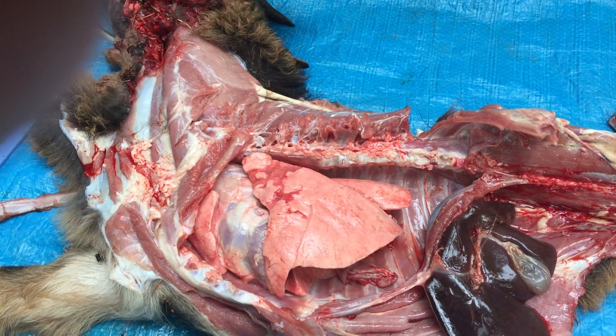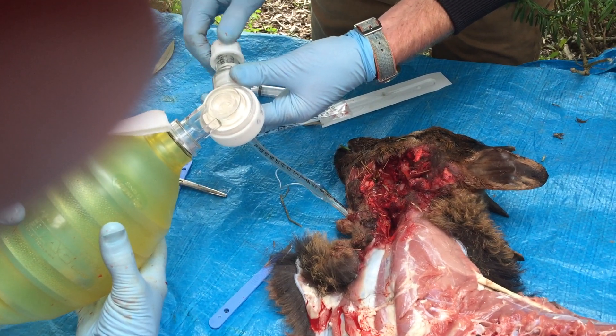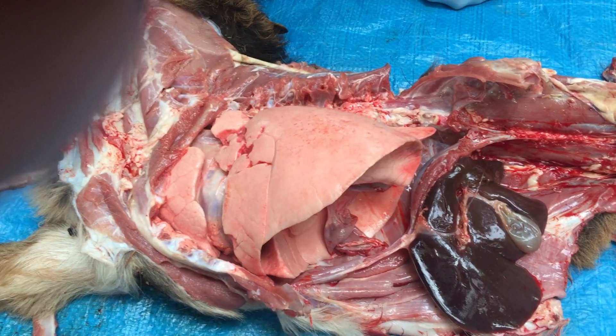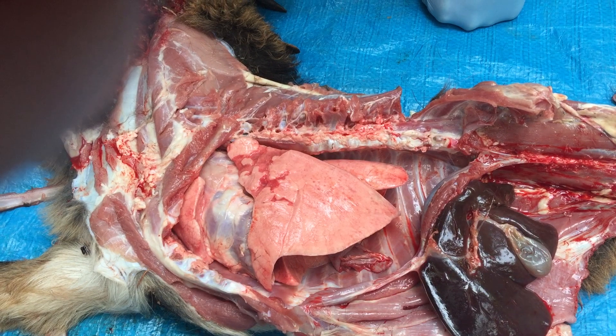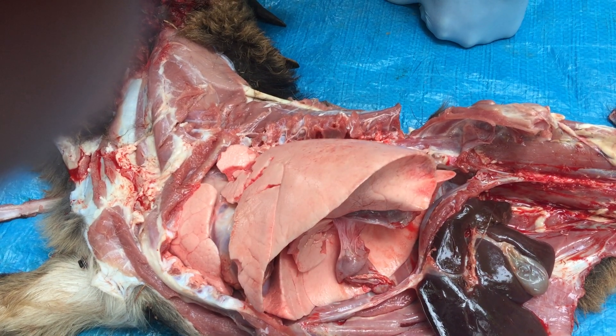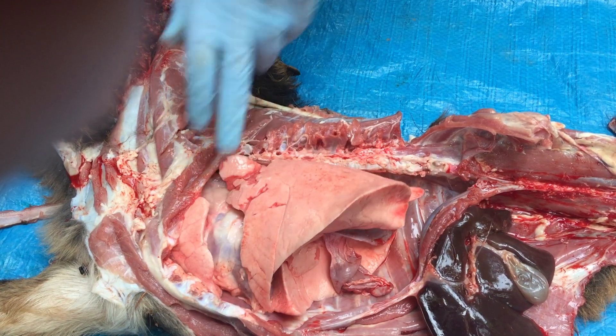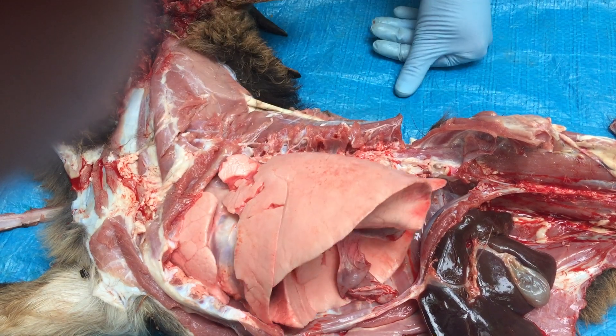Now we'll put that up to five of PEEP. This is five of PEEP. So they're still holding on to some of the volume, and we're seeing some of this area being recruited back here in the lungs.